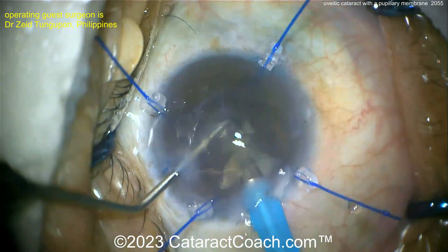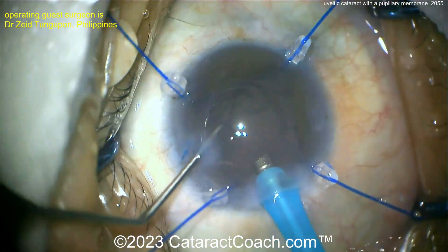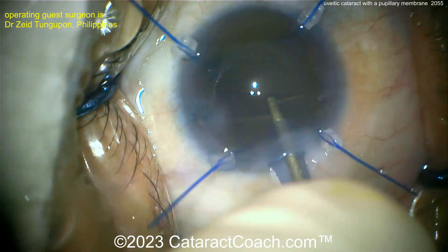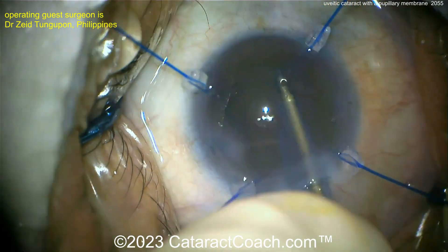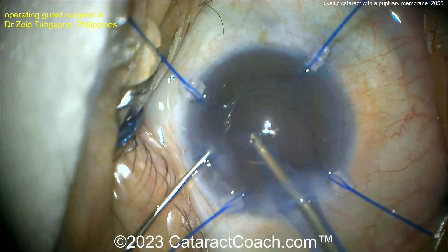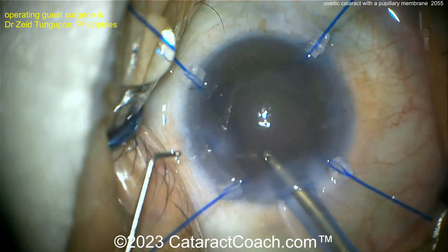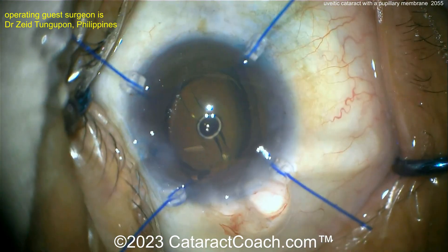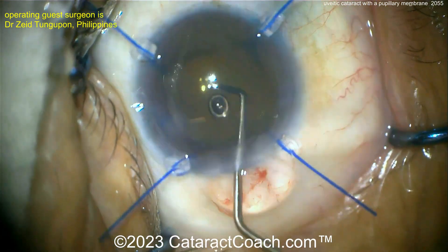The last few pieces are coming out now. Be cautious — the capsule bag may flop around, and there's usually not much cortex in these eyes to hold the bag back. Cortex removal: very little cortex. Now getting the lens in. A large rhexis in this case helps prevent future synechiae. You want optic overlap if possible, but do not end up with a baby rhexis — it makes nucleus removal very difficult with a dense lens. A nice acrylic lens is being opened in the capsule bag, and the patient is going to have a very nice outcome.